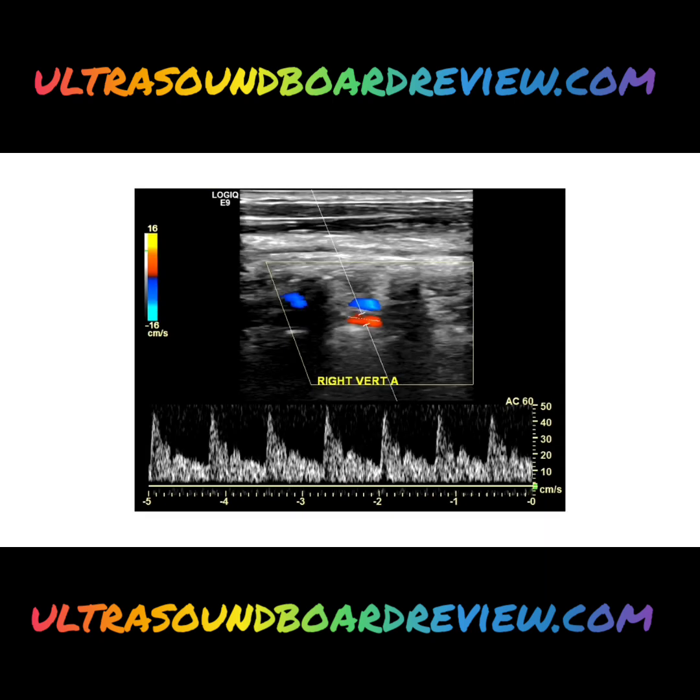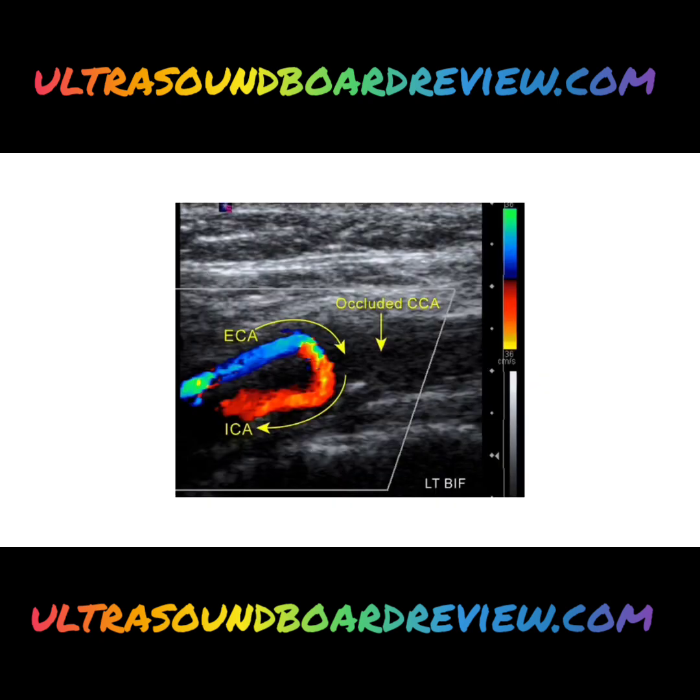So there are some really cool ways that you can use flow direction to determine where flow's coming from and where it's going. Like in this case, we've got an occluded common carotid artery. So we see that the flow in the ECA is actually retrograde. It's going towards our transducer, going backwards and wrapping around to the internal carotid artery, which is antegrade. There's our transducer there. You can kind of see how that's working.